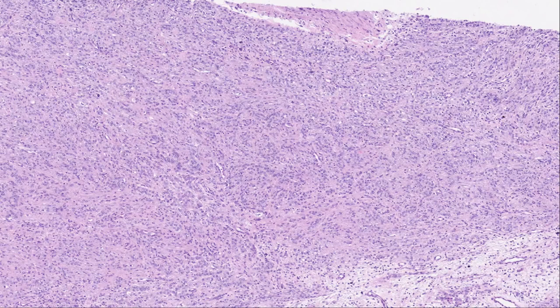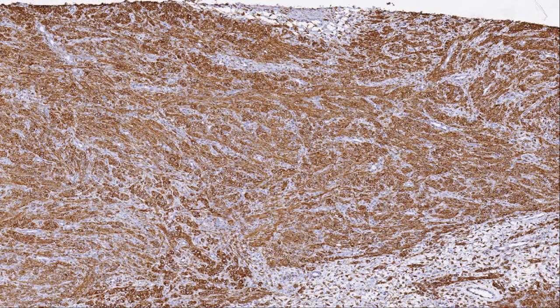Here's an H&E stained slide of a uterine cancer. The predominant morphology displayed here is that of spindle-shaped cells. The population of spindle-shaped cells can be of many different types, since cancers tend to make cells pleomorphic, which means that they become deformed. In this case, the cancer cells may originate from endometrial stromal cells, smooth muscle cells, Schwann cells, or even macrophages. Here's another stain, this one accomplished using IHC.